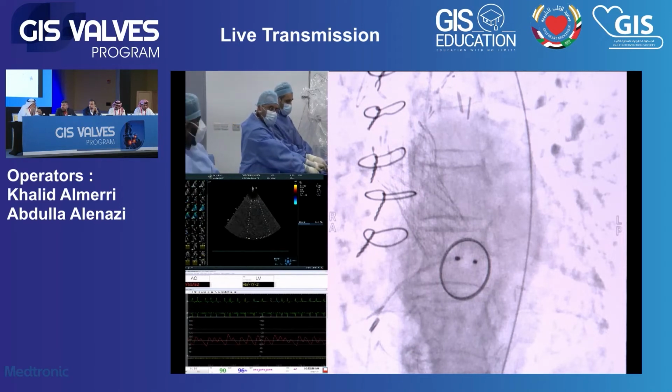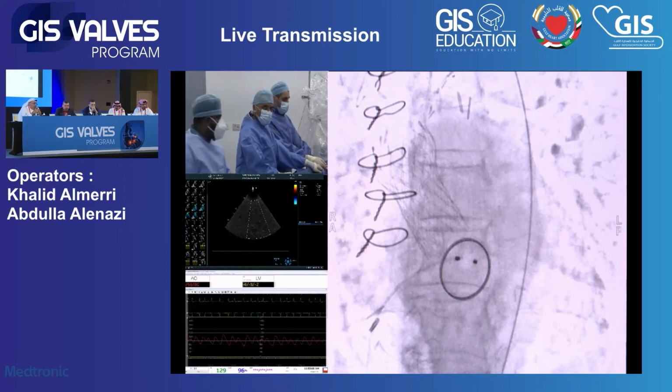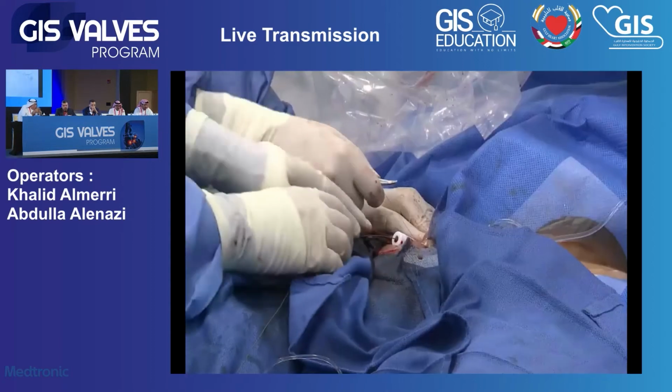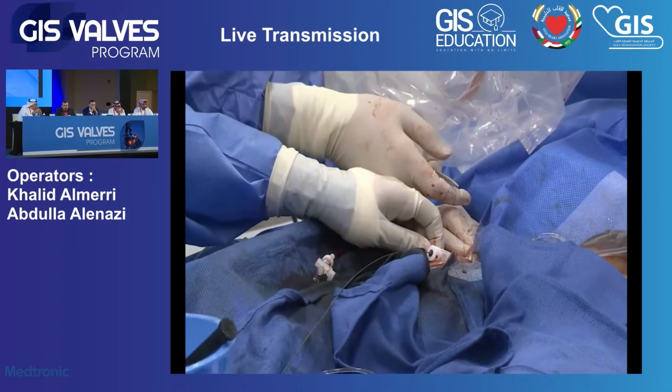The patient had moderate AR from the beginning. We shouldn't forget this. It was calcified, and we already have the new product, the Evolut PRO, with the pericardial skirt outside as a wrap. So that will take care of it with a self-expandable valve. We know that with time it will seal that as well.